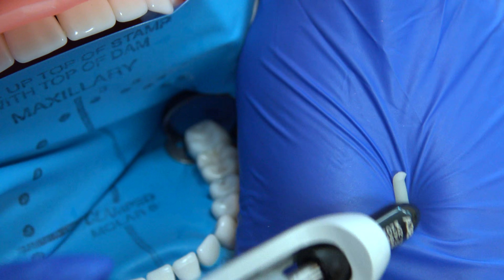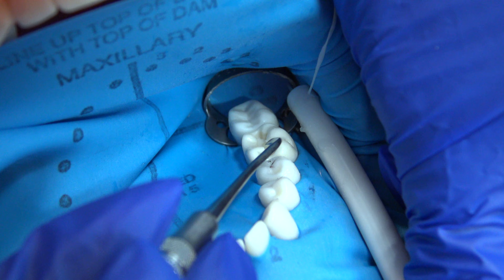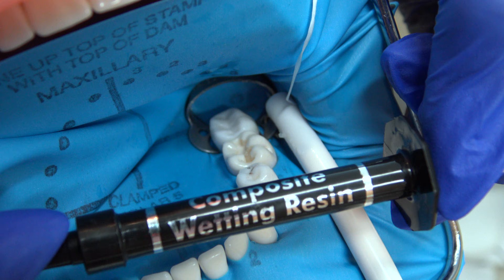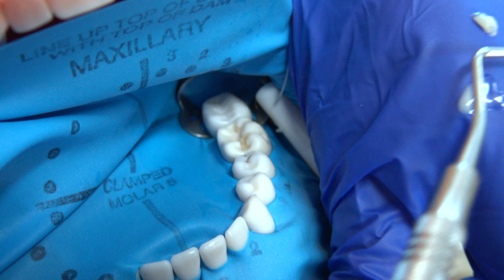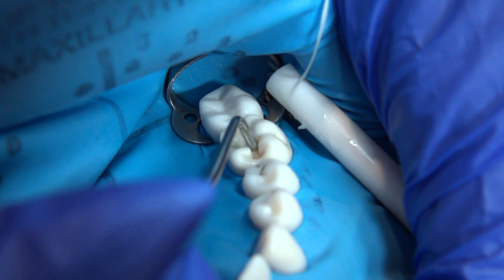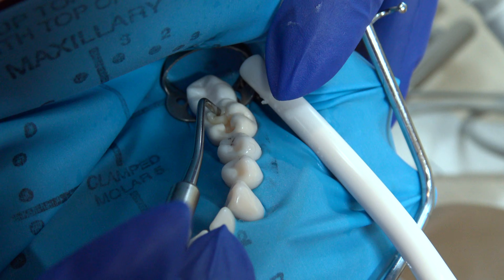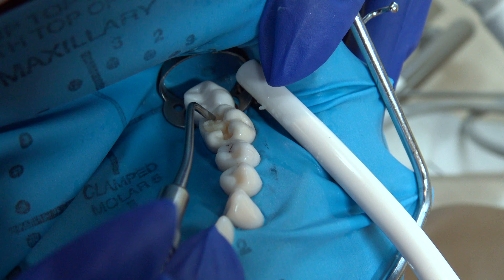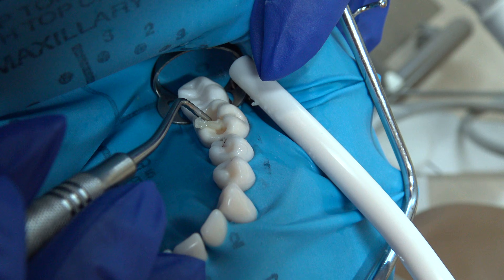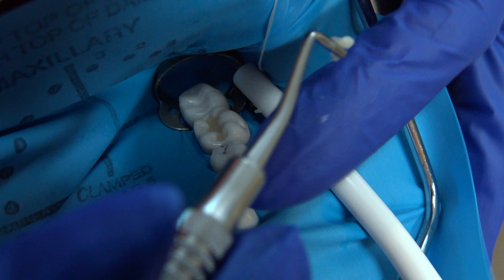Dispense a small amount of composite, and then you can use your plastic instrument to insert it. Now you can use your wetting resin — dispense a small amount to the glove, wipe the instrument, and then wipe off the excess. Do a push-pat technique for the first layer, with the first layer being two millimeters or less. This facilitates placing the anatomical features in the second layer. Remove any excess.